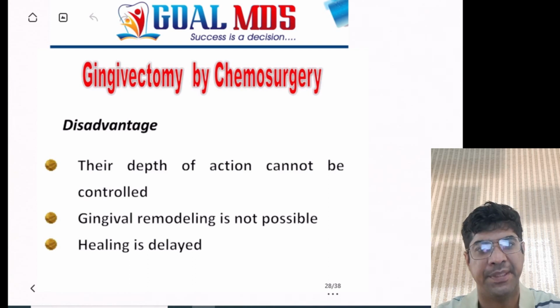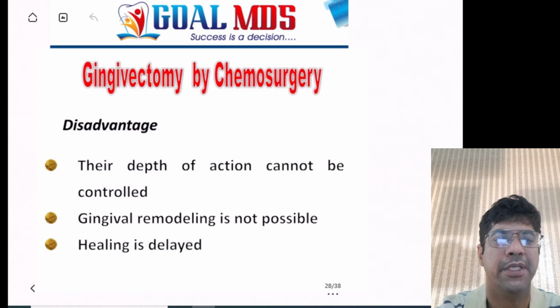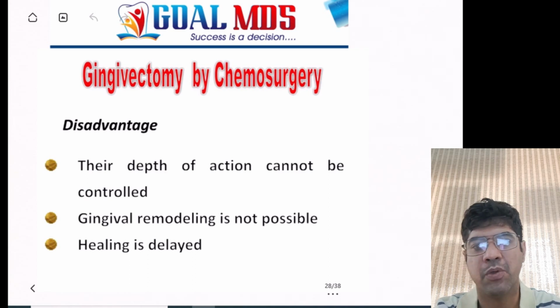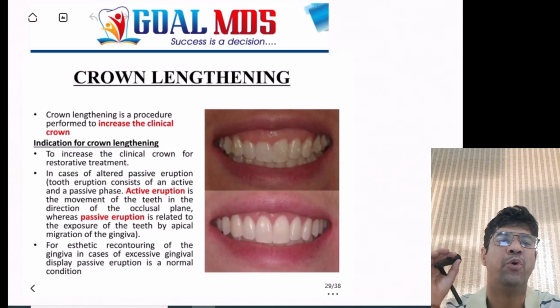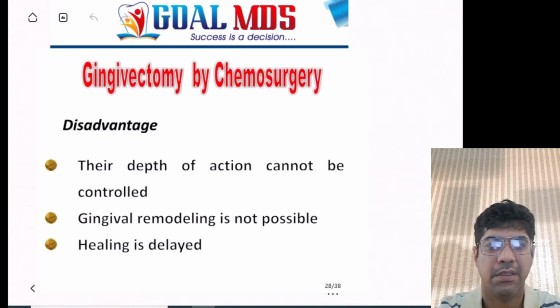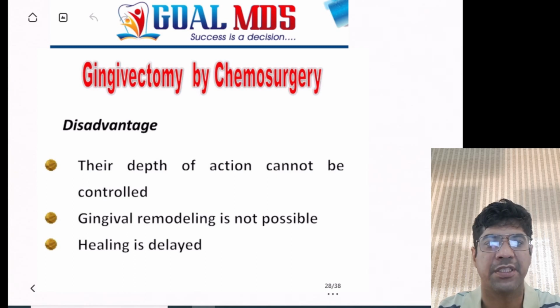Similarly, the patient is prepared for the procedure, often with local anesthesia to numb the area, and the area is again kept dry. A chemical agent, that is a cauterizing or tissue dissolving substance, is applied to the gum tissue. This chemical agent reacts with the tissue, causing it to dissolve or necrose, so that the procedure effectively removes the targeted gum tissue. The chemical agents may control the bleeding during the procedure, and the patient will receive post-operative care instructions for oral hygiene, diet, and managing any discomfort or swelling.